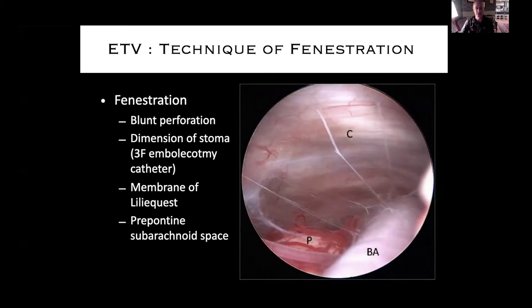In the pre-pontine subarachnoid space, it's always nice to get a look down here, even if it's just a quick peek. The basilar artery is coming vertically at you — sometimes you can barely see it. You can see the front of the brainstem; P is for pons. All those white fibers are the membranes of Liliequist going from the brainstem across the clivus. These stringy fibers are fine — it's when there's an occlusive membrane that CSF flow won't be adequate. You want to take a quick look through the stoma and make sure those membranes are fenestrated appropriately.